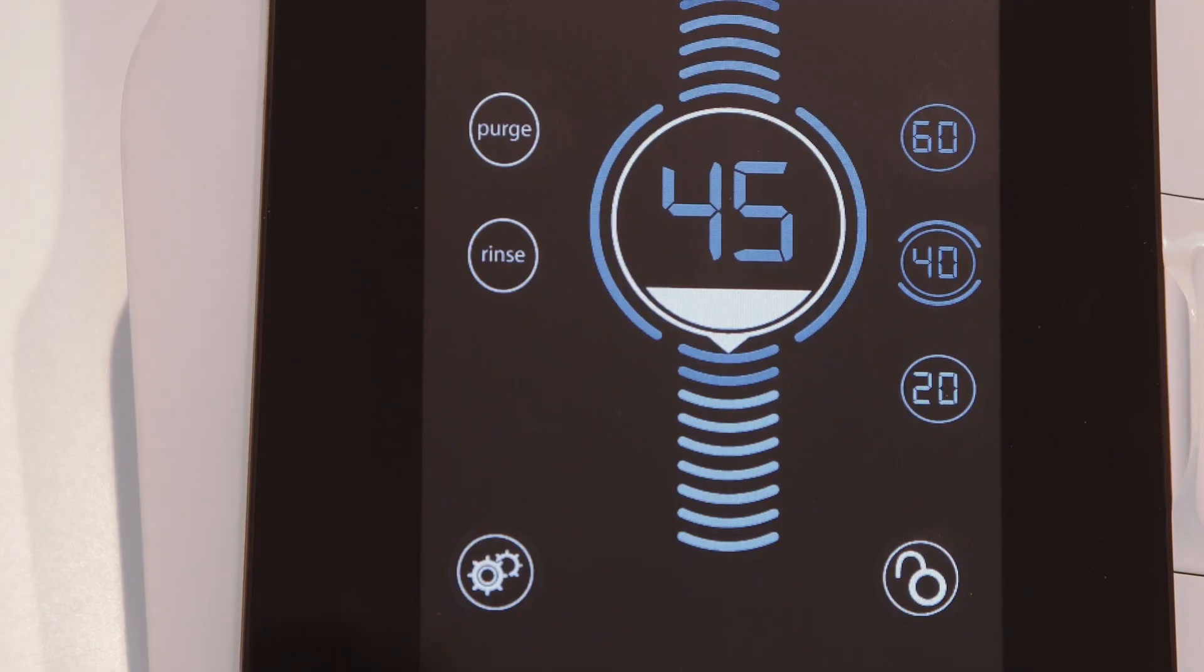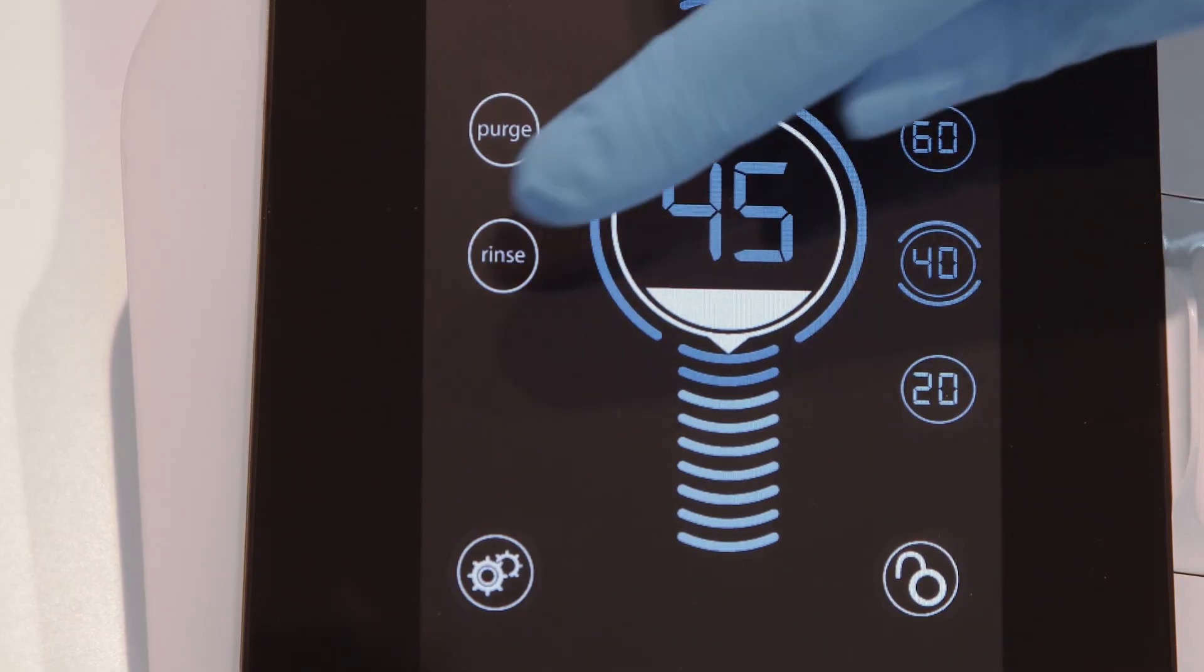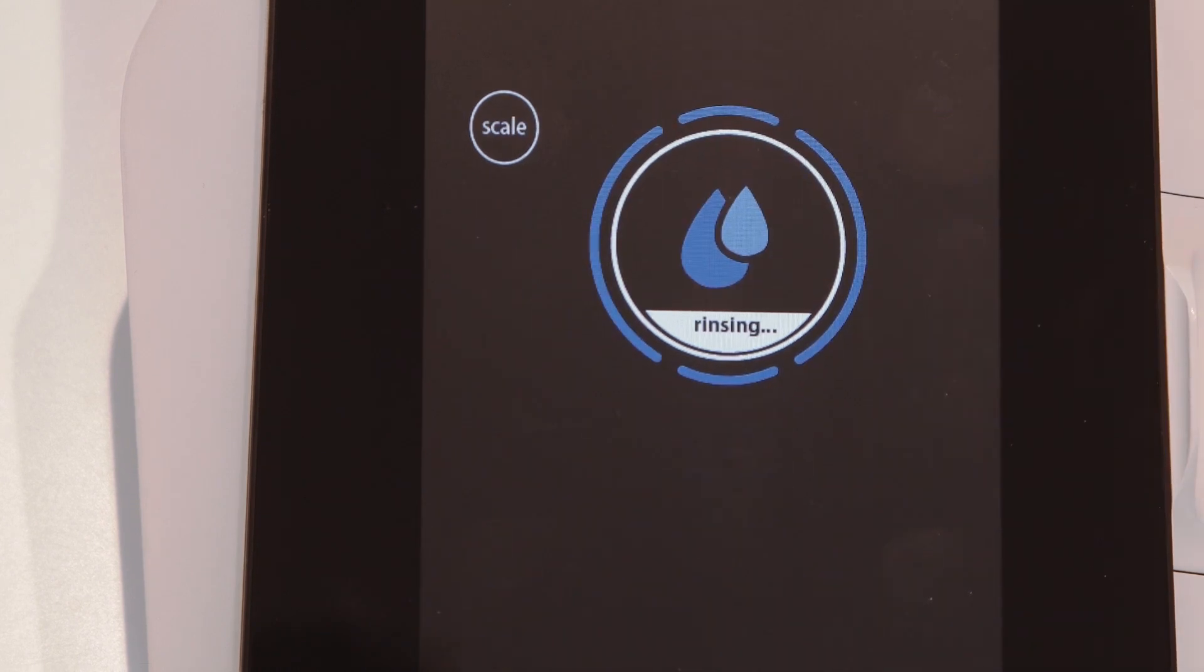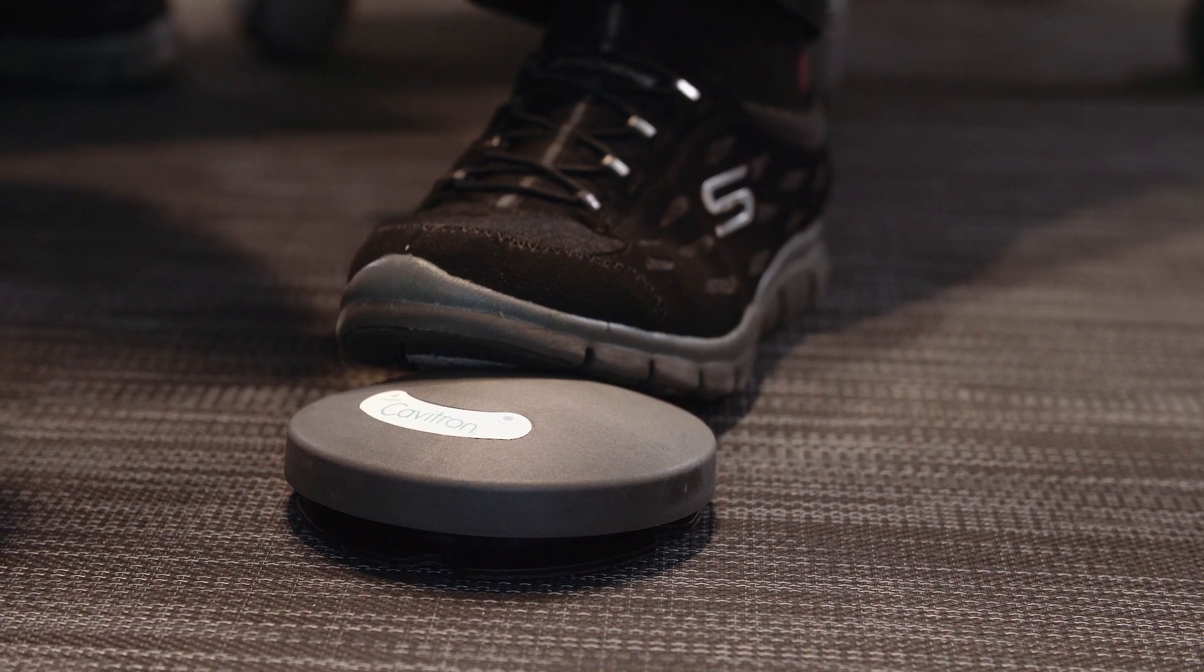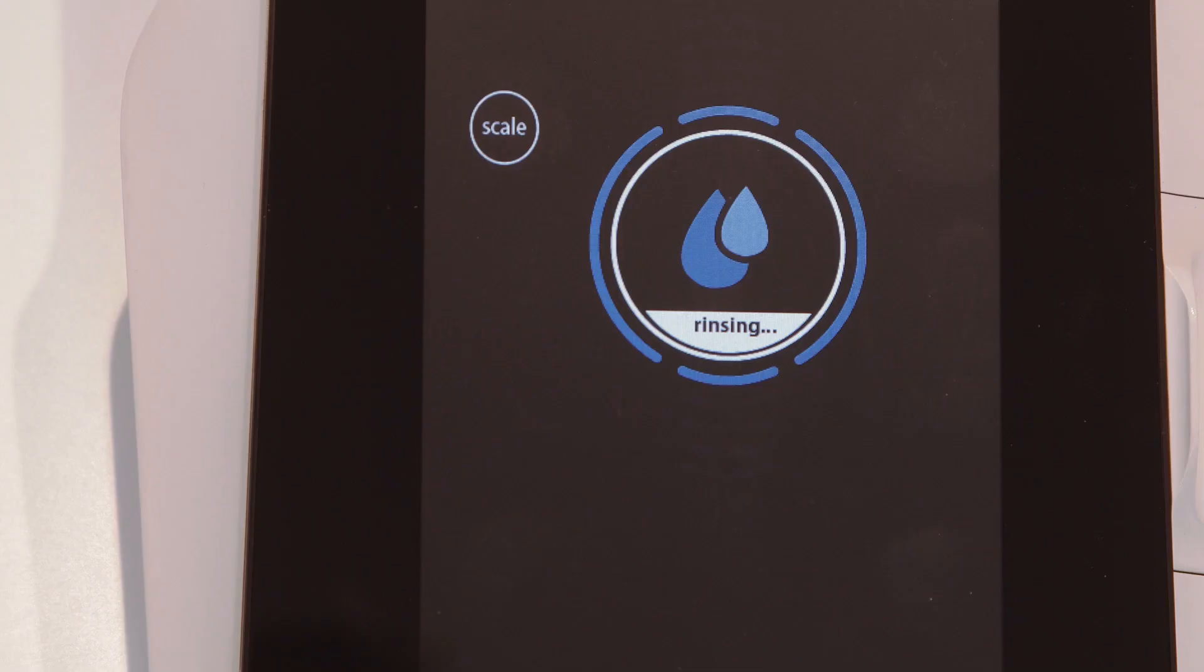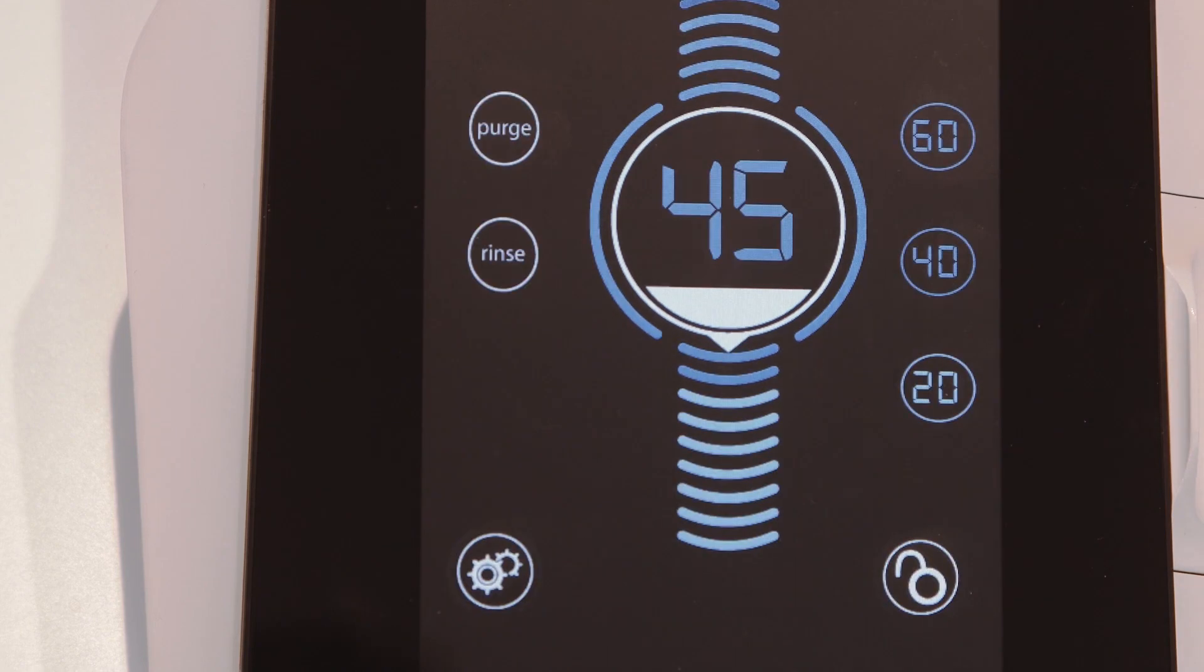Users will operate this feature during an ultrasonic scaling procedure when lavage is desired with no cavitation. To use, depress and hold the foot pedal for rinse mode cycle. To exit rinse mode, tap the scale button to return to the main screen.